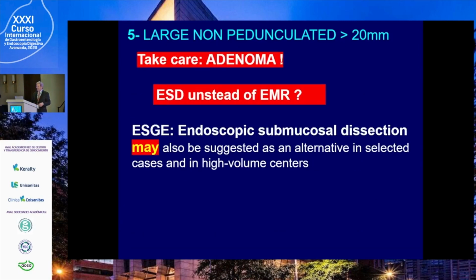Now, in case of adenoma, why not do ESD instead of EMR? Because EMR is not perfect. You never know, okay? You are obliged to destroy the margins. With ESD, you can be R0 immediately.